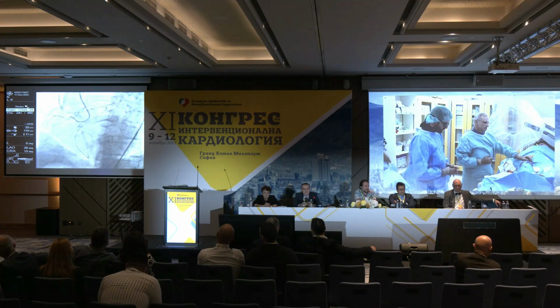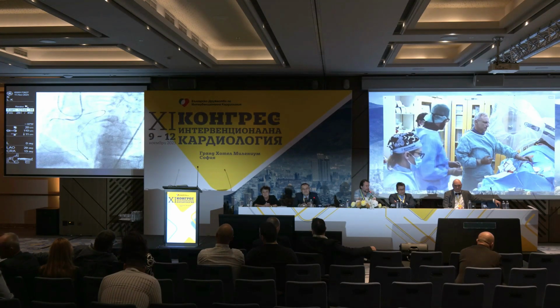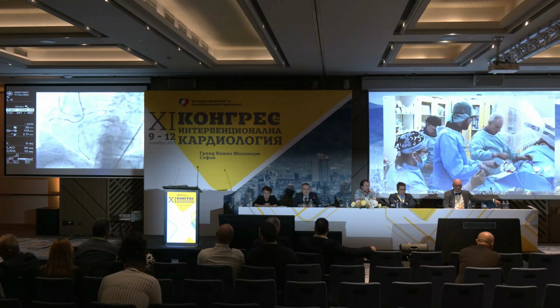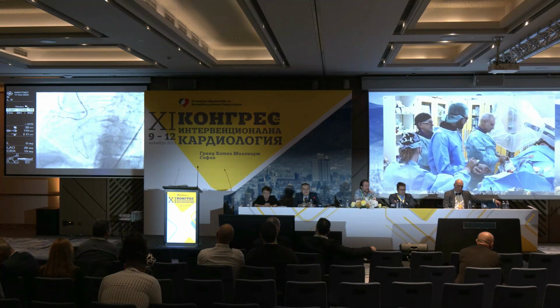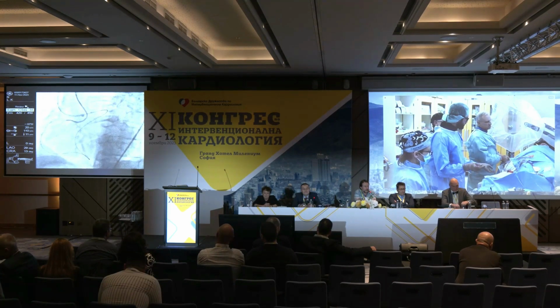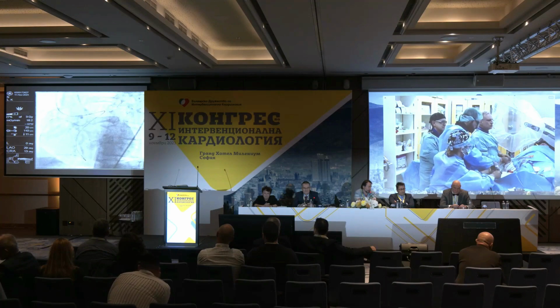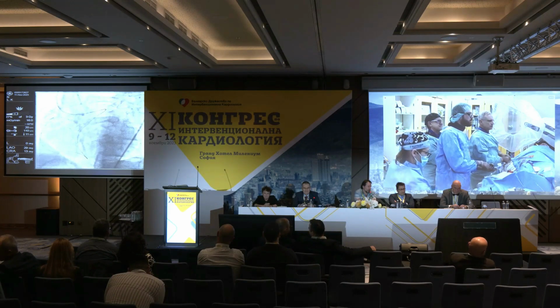You see here, you give contrast and you reach the target vessel antegradely a little bit. I think that created some kind of fenestration, I don't know. And that's maybe the reason you go in so easily. What do you mean fenestration? Yeah, you give contrast, you dissect it further with contrast antegradely. You created more fenestrations, I think, from different planes after giving contrast antegradely. I don't think so, but anyway, it might be. I'm not sure whether it is the case, but this is too much thinking for me. I just focus on where is that balloon?